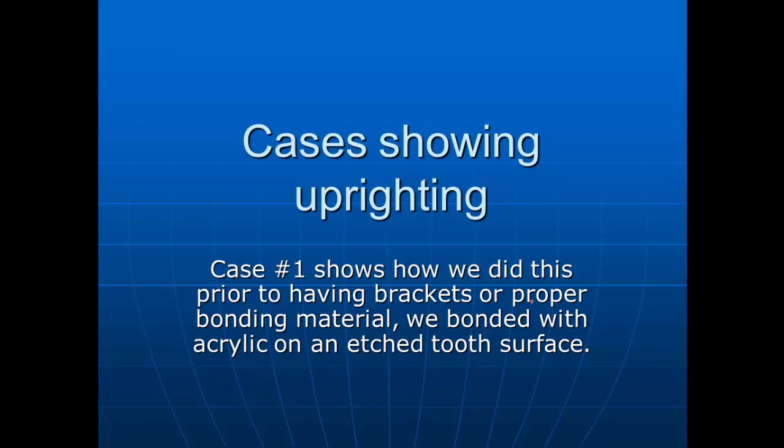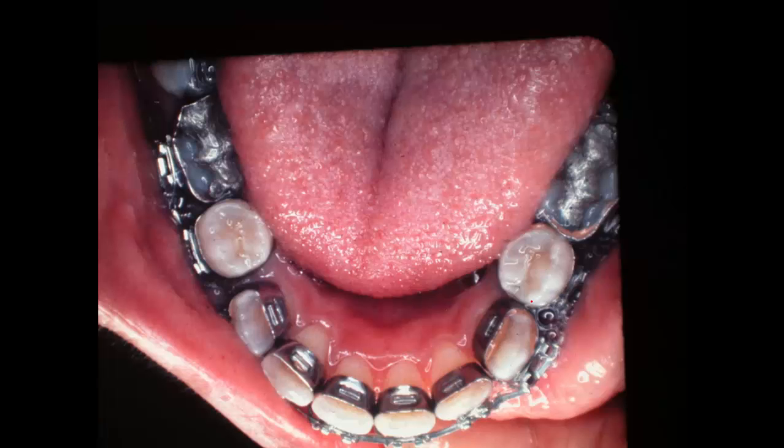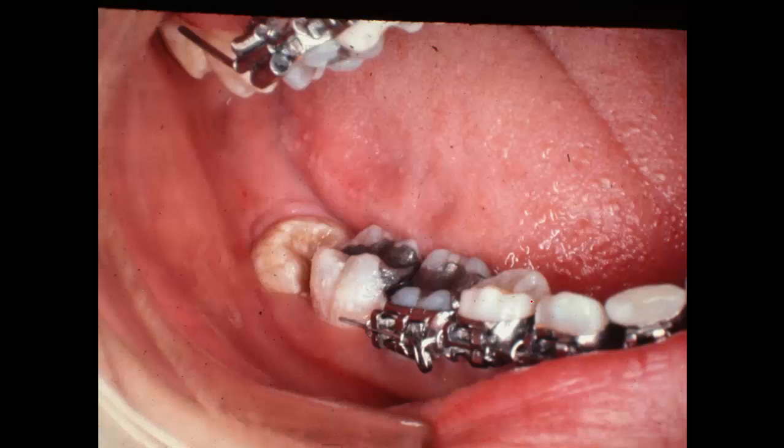Now here are some cases where we'll show a few of these, and I'll try to keep the time down on this. We've been in about a little over 20 minutes. This is the first case that I kind of learned the mechanics of it. We had treated this young lady, and I took out some bicuspids to treat her case. This is way back in the 70s when we had to band all the teeth, and I didn't have any brackets or tubes to bond on the tooth, so I had to come up with another way to do this.